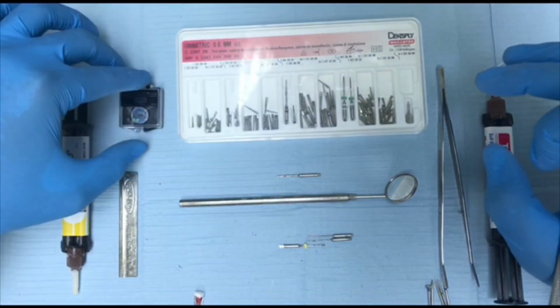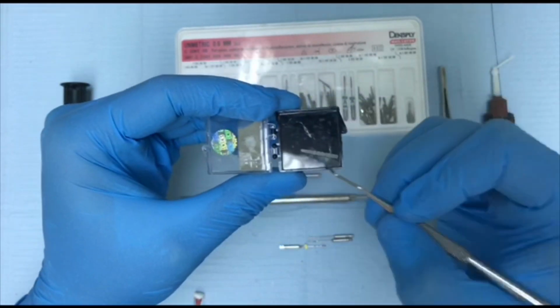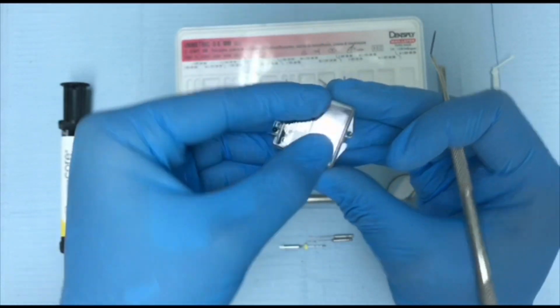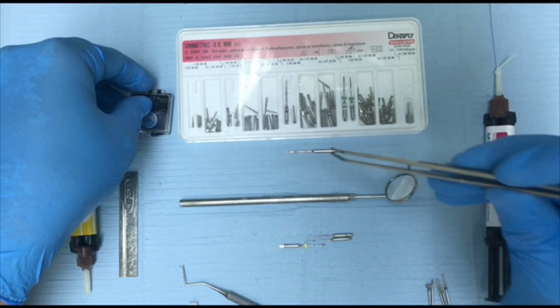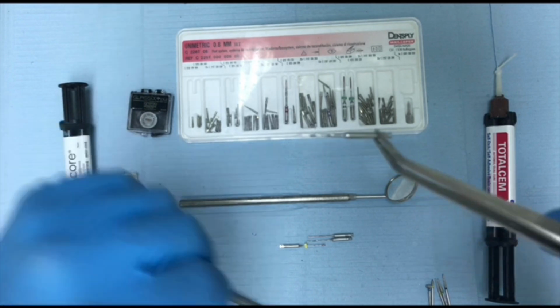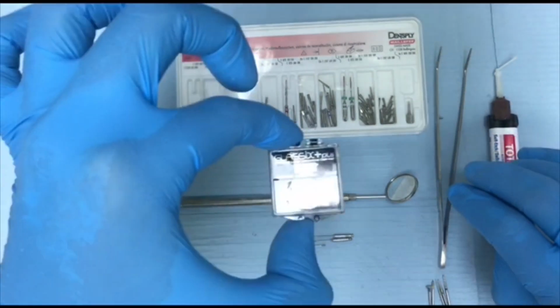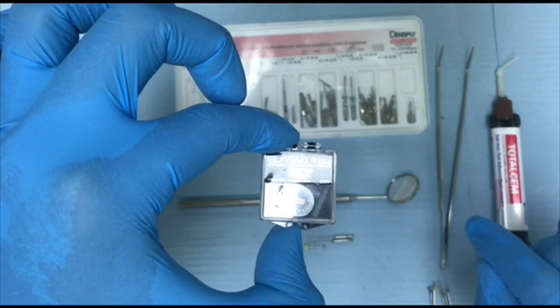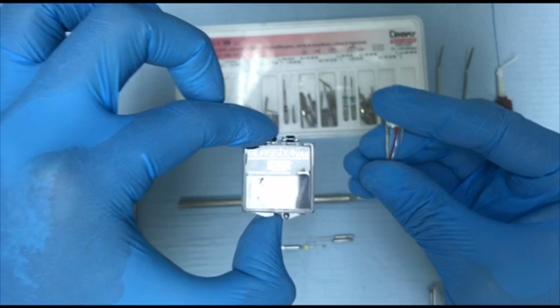And this one also is the fiber post. This is the fiber post, and this is the corresponding drill of the fiber post that you are going to prepare your canal with. In this video, I will demonstrate how to place a fiber post inside the root canal system of an endodontically treated upper anterior tooth.